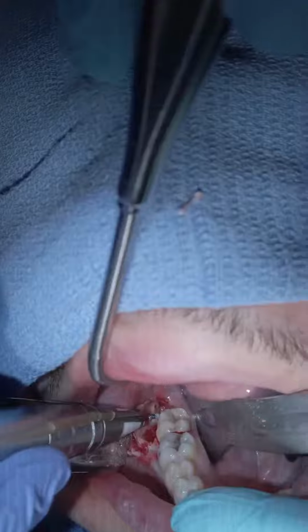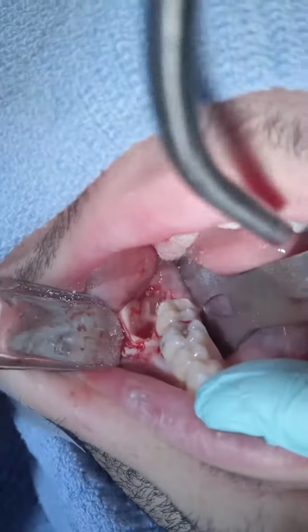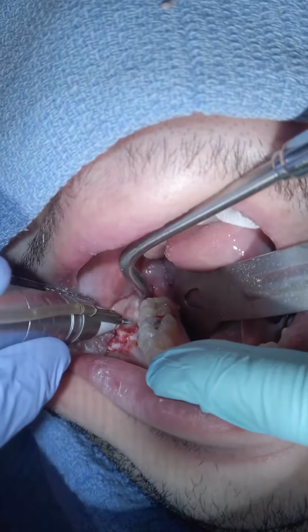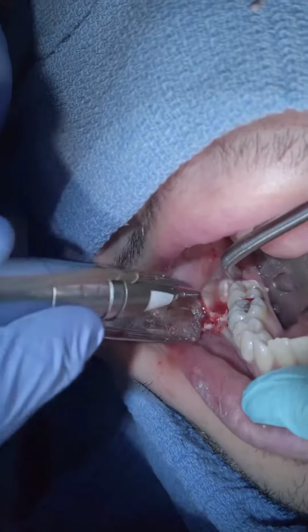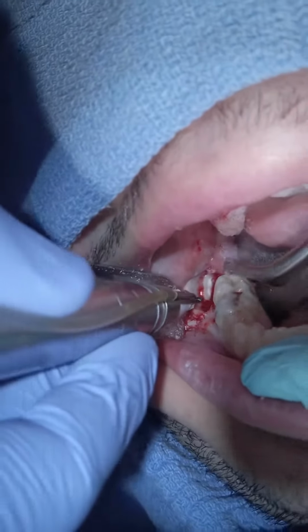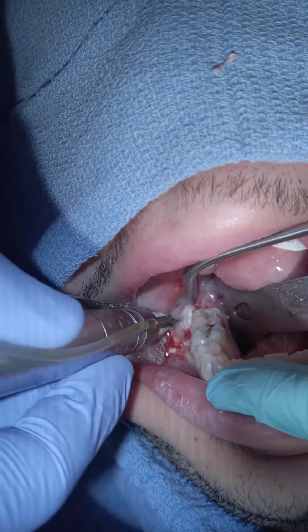Okay. Look in here real quick, Chris. You see those are the roots right here? What we're going to do is go right on top of that. We're just going to remove a little bit of bone right here. Now there's two ways of doing this. I could split right there and take out the roots individually if I want to. Sometimes you have to do that. I don't think on this one we do.